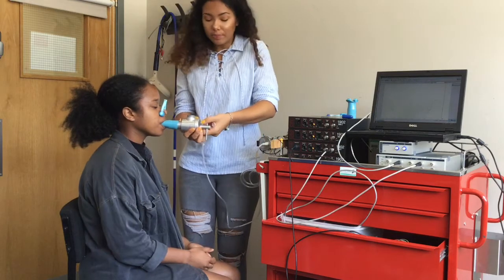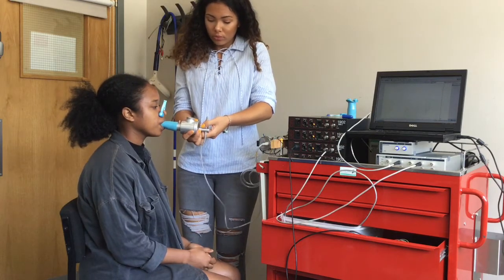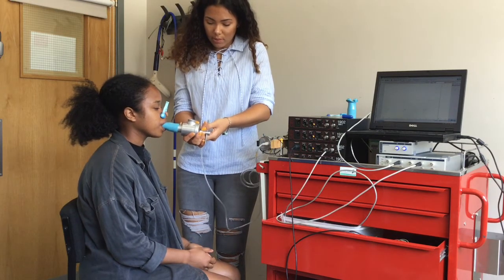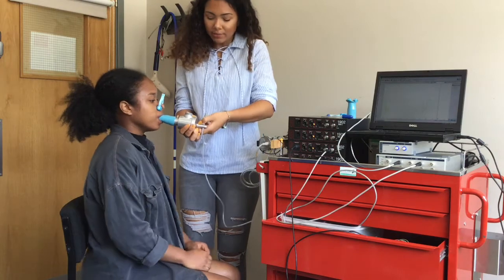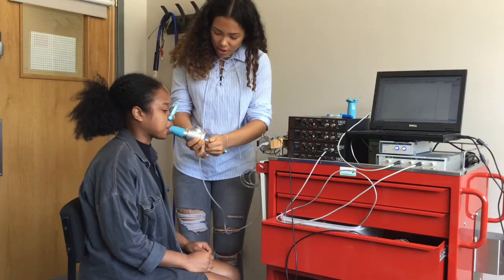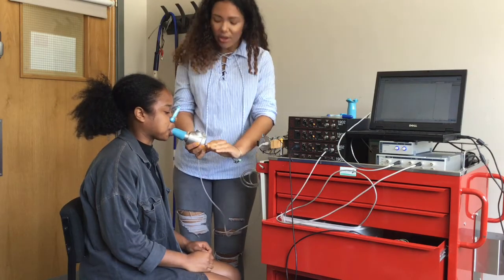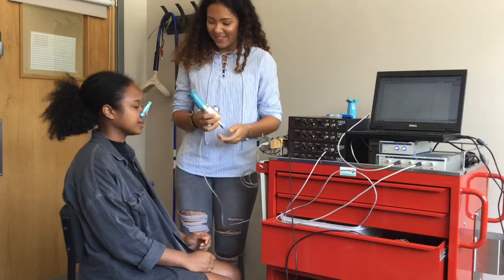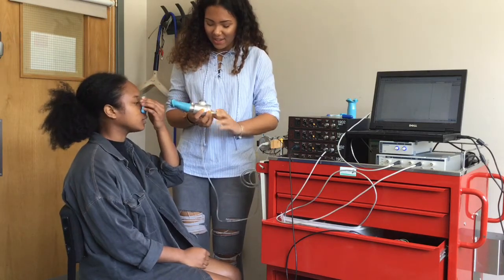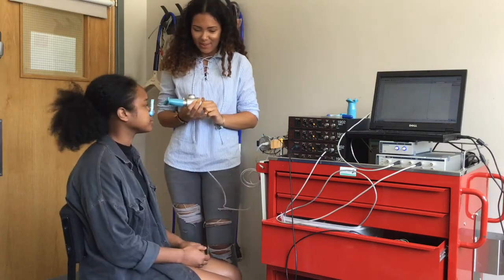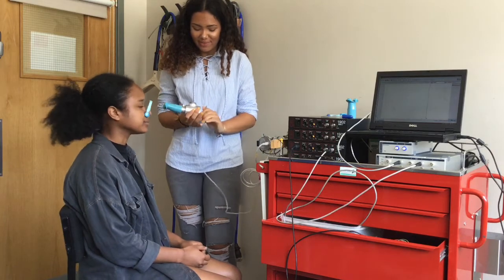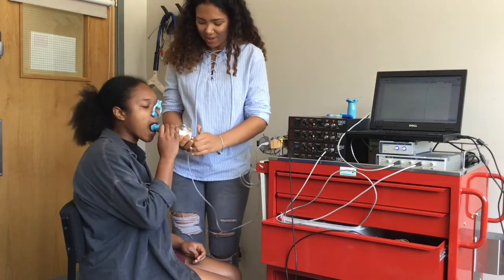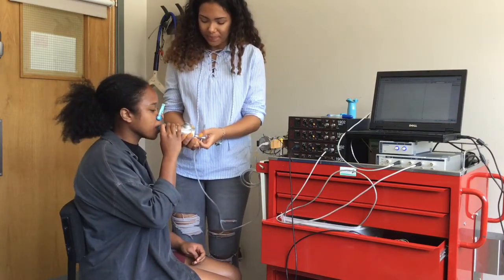There are two forms of mouth pressure testing. Measurement of the maximum static inspiratory pressure PI max and the maximum static expiratory pressure PE max. Both are measured with a mouthpiece attached to a valve system. The valve system incorporates a small leak to ensure that respiratory rather than facial muscles are assessed.